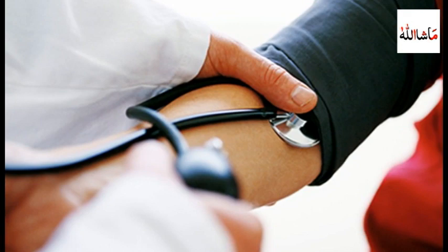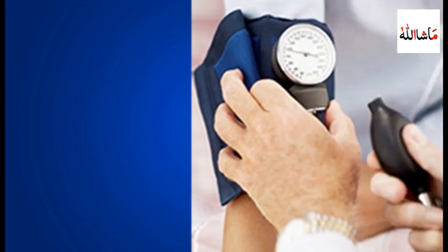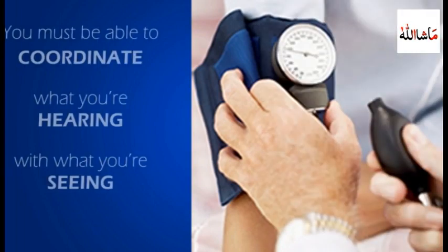There are several steps involved in taking a blood pressure measurement, and each step must be completed with accuracy. This is especially true when viewing the blood pressure dial and listening with the stethoscope. You must be able to effectively coordinate what you're hearing with what you're seeing.